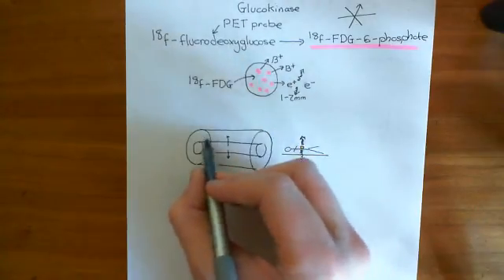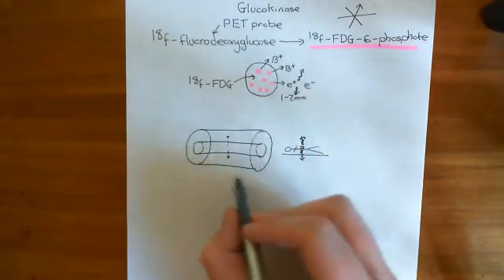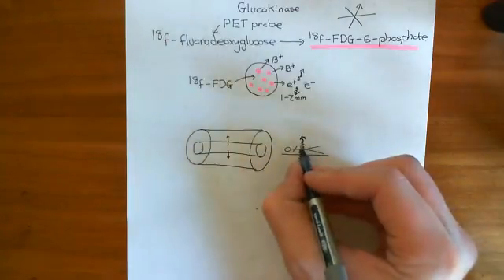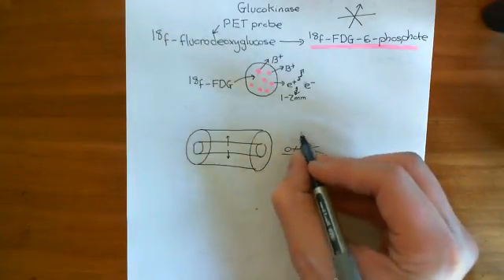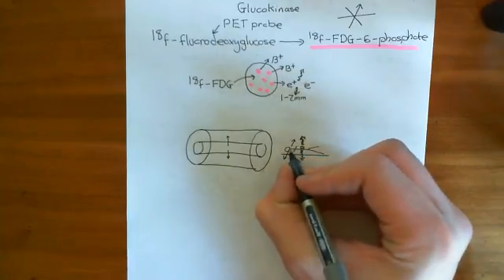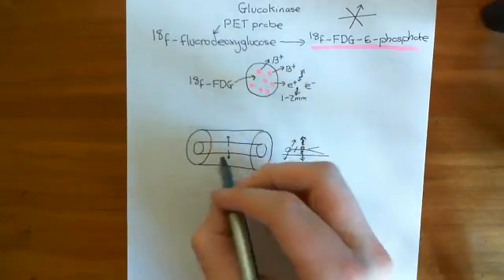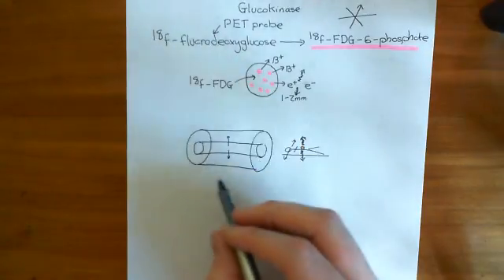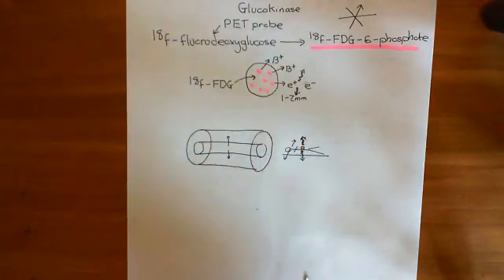So what the PET scanner then does is it detects these photons. So it will have a detector up here. It will have detectors all around because it's not necessary that the photons are going to come off vertically and this way. They could go off sideways. They could go off to the patient's left and to the patient's right, which is why the detector needs to go all the way around.